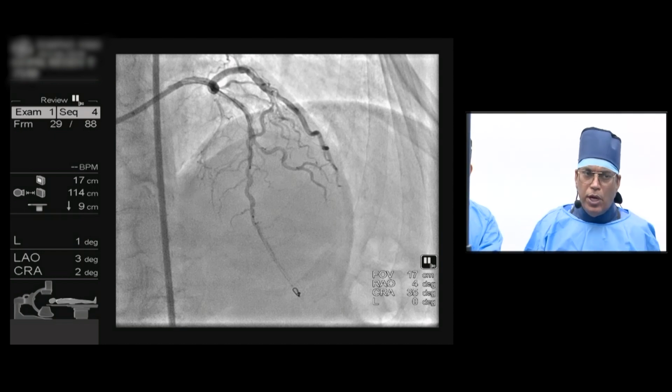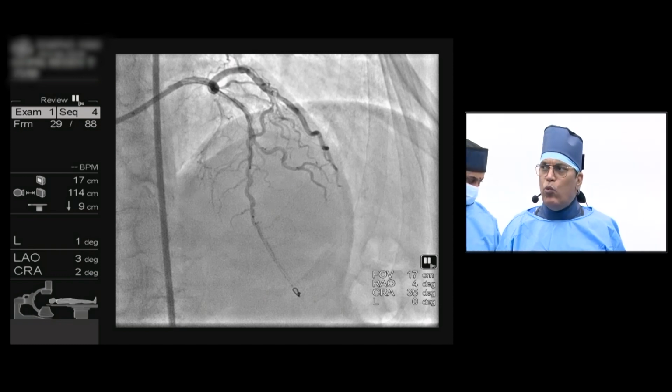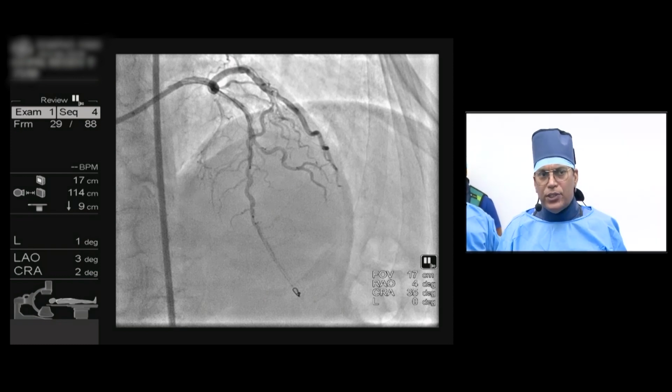So what kind of plaque modification here, whether to go with rota or orbital atherectomy? Our patient has unstable angina, LCX and RCA were recently done, and it is a large vessel, almost like a distal LM, 4.5 mm, and the proximal LAD is also almost a 3.5 mm vessel. So, a large vessel and deep calcium. For ablation of deep calcium in a larger vessel, orbital definitely has a superior role compared to rota.